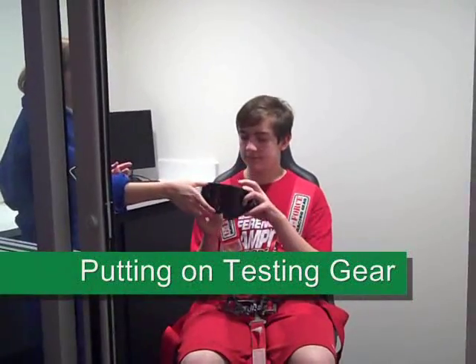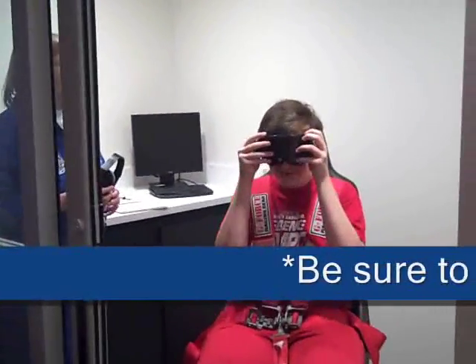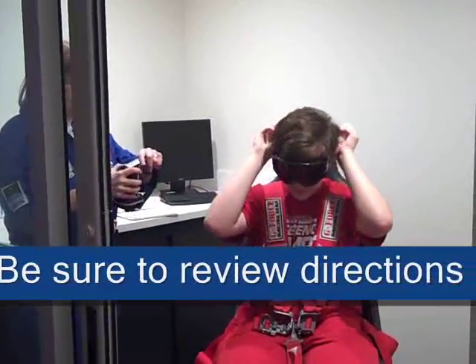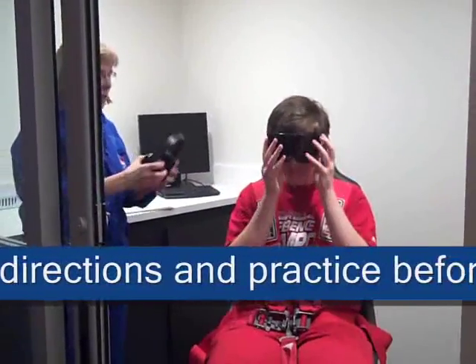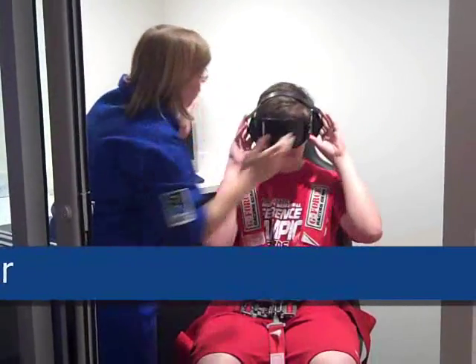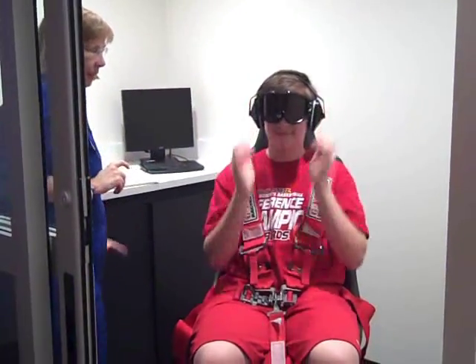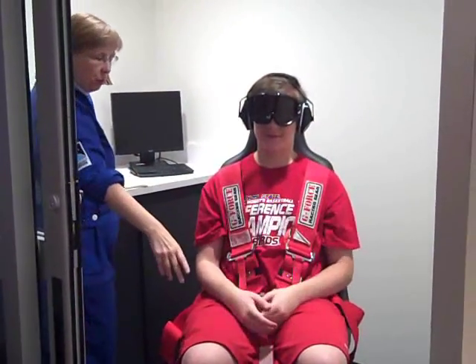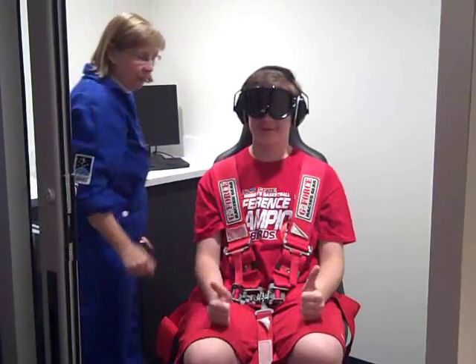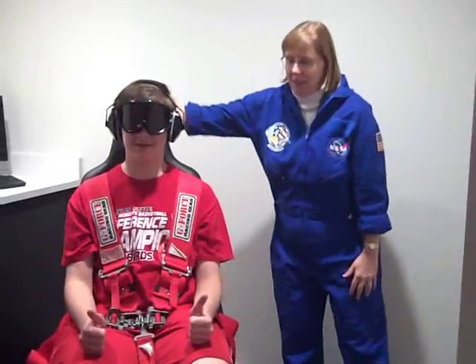Allow the crew member to put on the covered goggles themselves and then assist them in putting on the headphones. Make sure their feet are in position and their thumbs are ready and pointing up. Your med station teammate will hold the stopwatch while you stand by the chair and count 3, 2, 1.